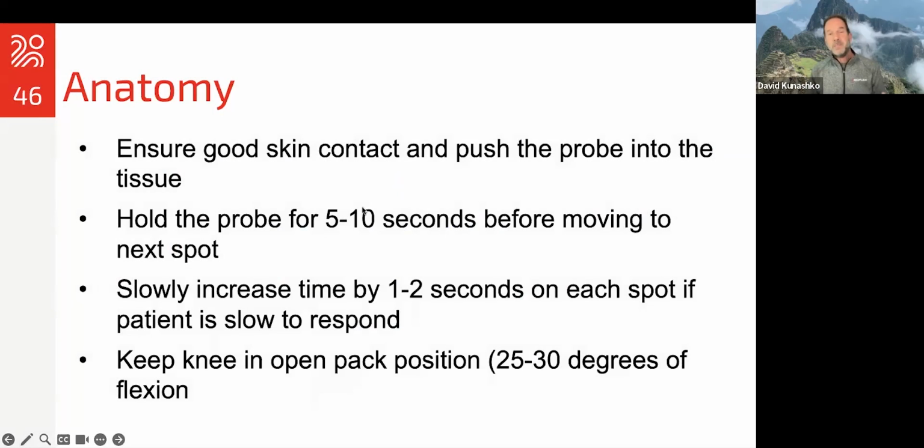So a few other tips: ensure there's good skin contact with the laser probe and the treatment array. I've mentioned holding the probe anywhere from 5-10 seconds, maybe even a little bit longer. You can slowly increase the time that you hold the laser probe on each spot if the patient's a little bit slow to respond as well. And remember, you want to keep the knee in an open pack position, roughly 25, 30 degrees of flexion.